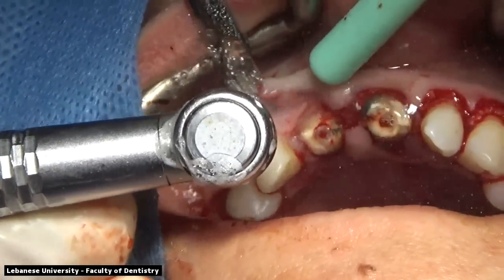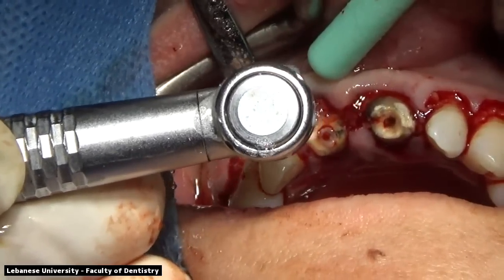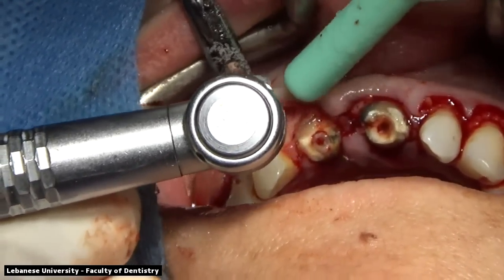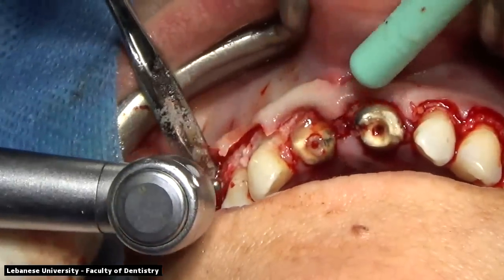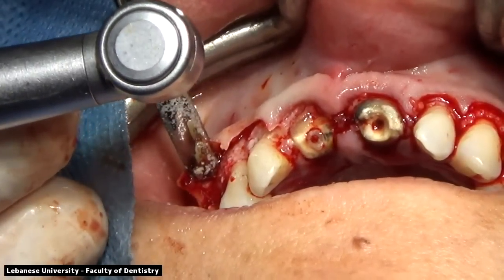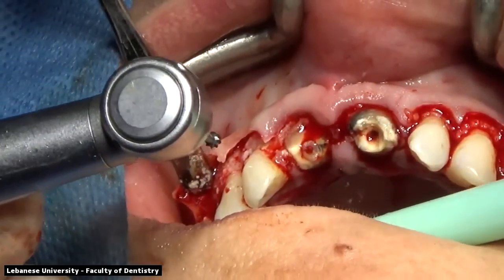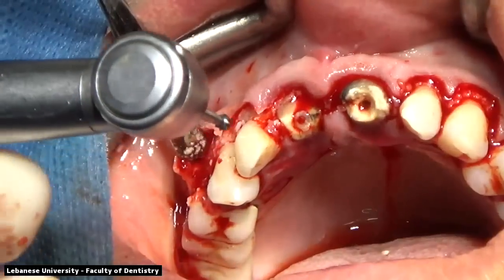Now we're doing our best not to touch the tooth surface with the round burr. The round burr has to be a diamond round burr that's going all around the margins of the cementoenamel junction, touching the bone levels. We're trying to remove about 1.5 to 2 millimeters of the bone level, so that we can create an efficient biologic width to prevent the relapse of this soft tissue. After performing this ostectomy procedure, we will proceed with the osteoplasty procedure, which will remodel this bone around the tooth surface and create a blended surface, so that the soft tissue can close without tension or without any ledges or any gaps.